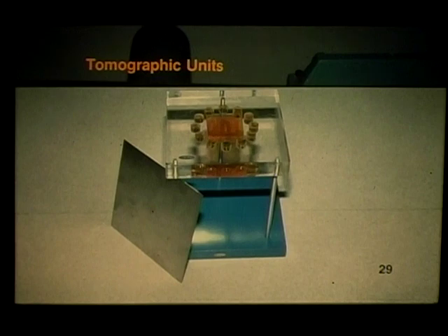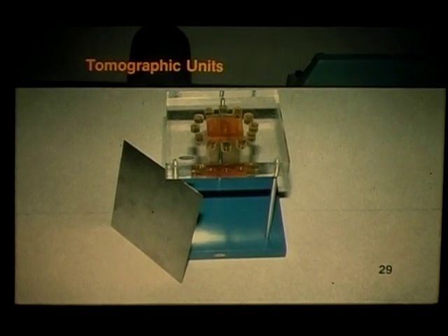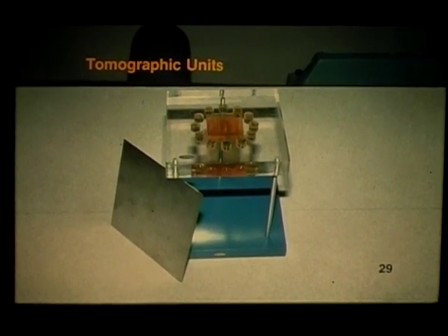Number 29. For tomographic units, tests should be performed for KVP and timer accuracy, MA linearity, beam alignment, half-value layer, exposure reproducibility, and focal spot size consistency. These tests were described in Lesson 2. In addition, a tomographic phantom and a steel aperture plate are needed to test the accuracy of this specialized equipment.